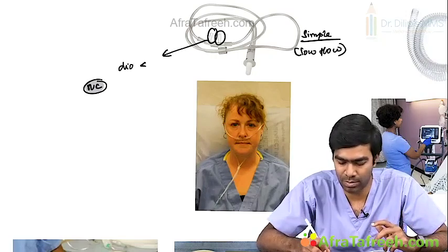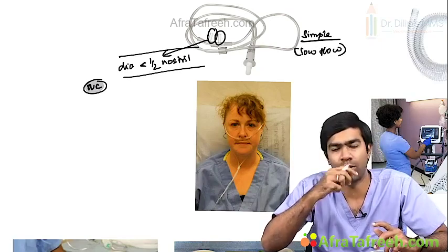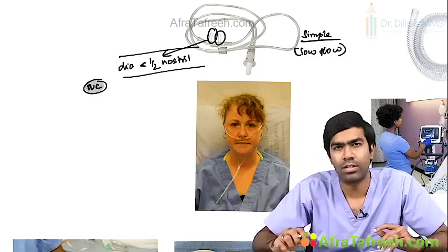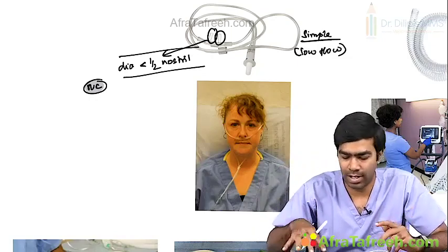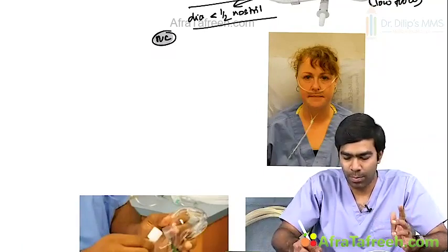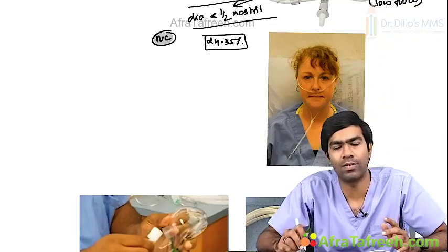The diameter of the nasal prong should be less than half of the nostril diameter. Very, very important. It should not be completely filling the nose. So this is the mandatory criterion that has to be followed. Clear? So what is the amount of FiO2 that it can deliver? Remember, usually the FiO2 that it can deliver is only up to about 24 to 35%. That's what I believe.